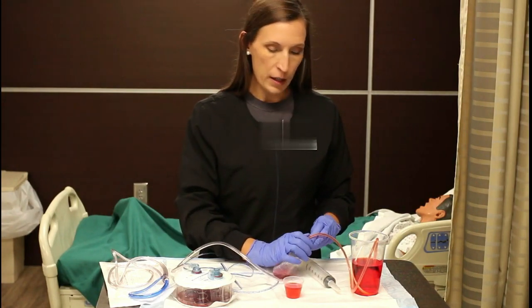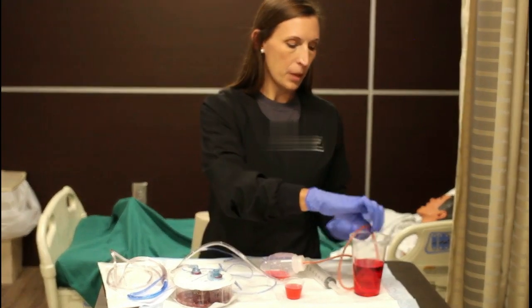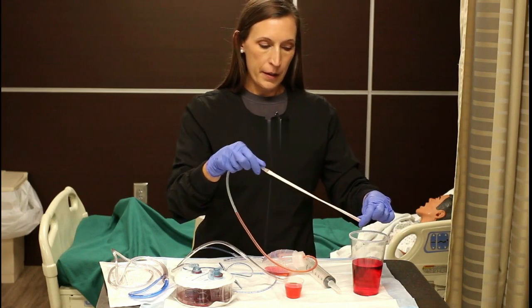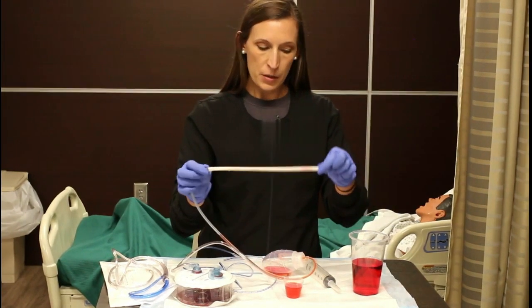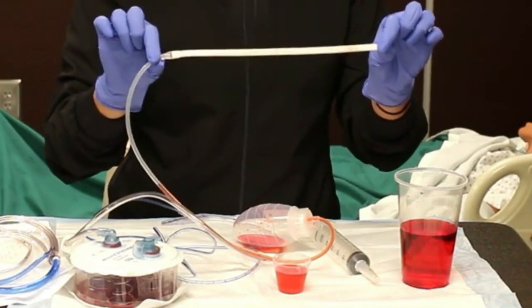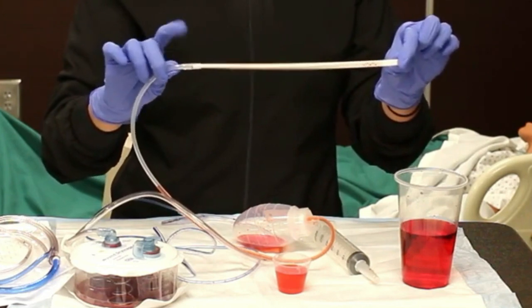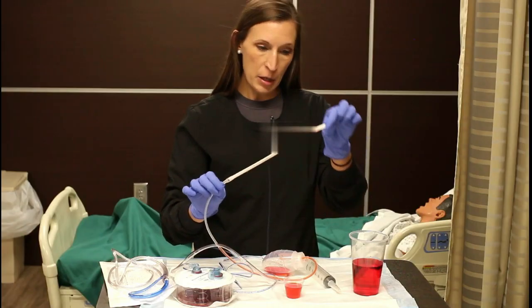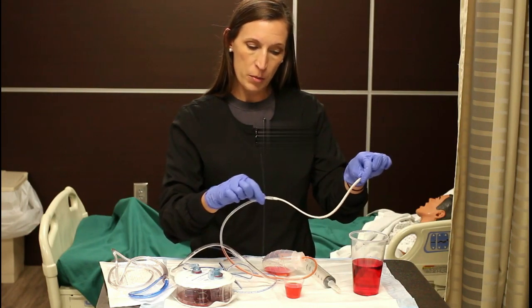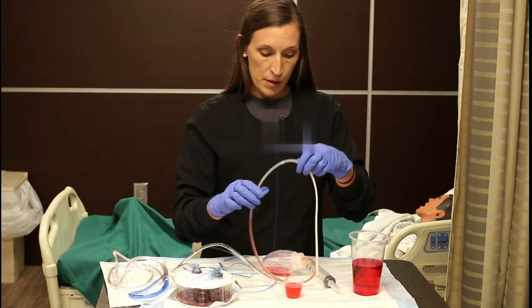Let's look at what it looks like inside the patient. This is what the JP drain looks like inside. This whole white piece is inside and then it's sutured right here around to the patient's skin. It has a bunch of little holes in it where the fluid can accumulate, and when you activate the suction, it sucks it all in.